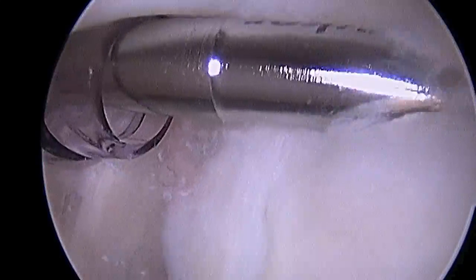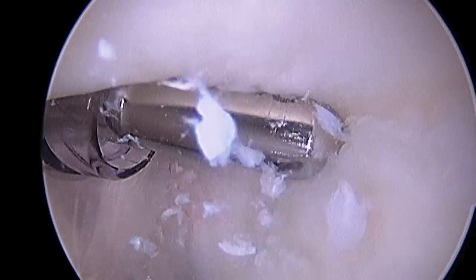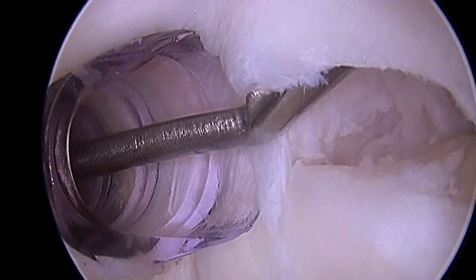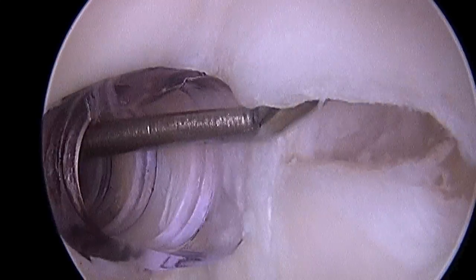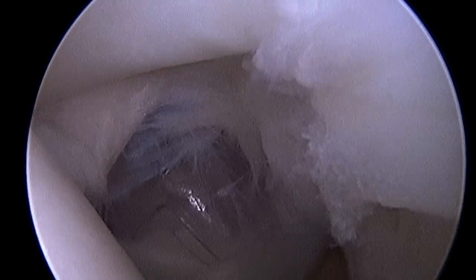Here you see an arthroscopic shaver. What we're doing here is removing any early healing tissue. Additionally, we're scuffing up and abrading the bone so that it'll bleed. You can see that the superior labrum has been mobilized here. That bleeding bone is what allows healing and that's why it's a very important part of the procedure.